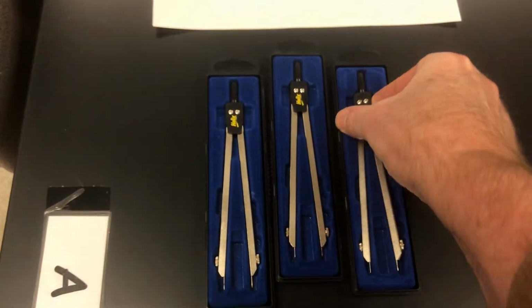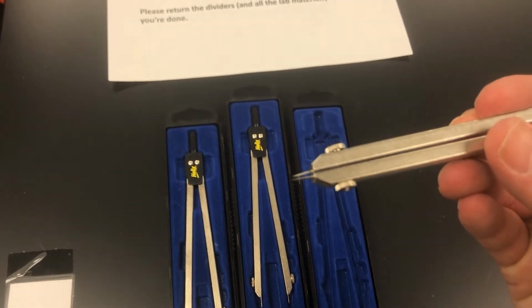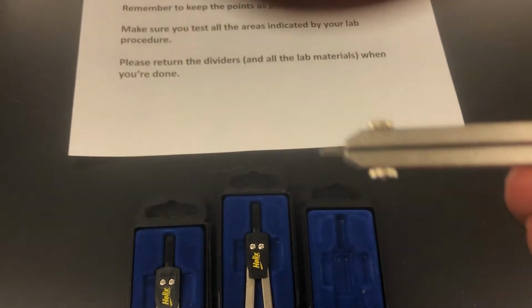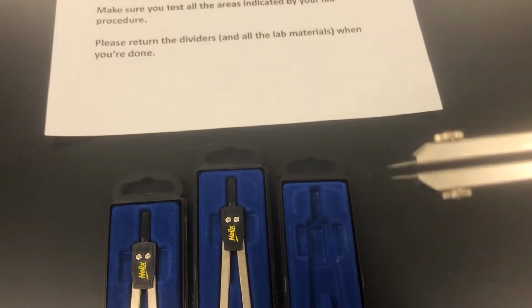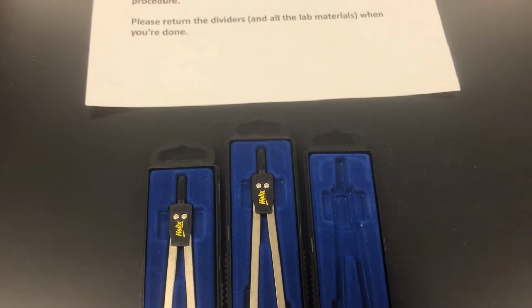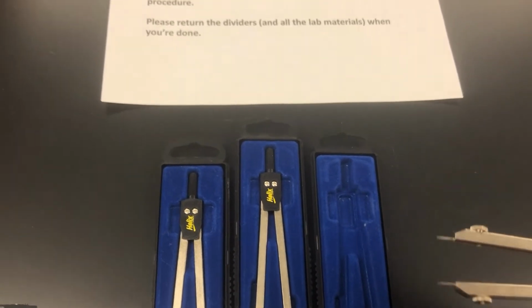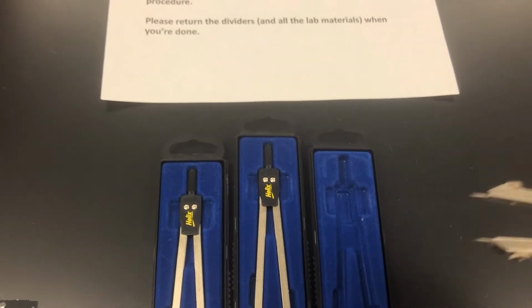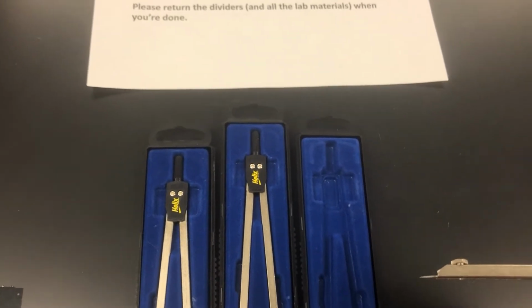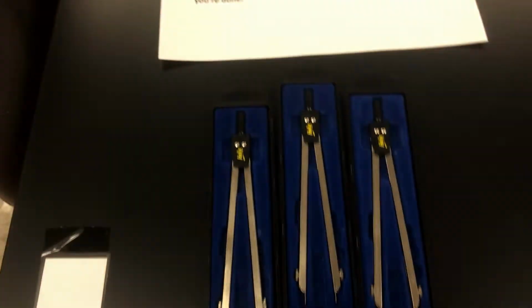For the somatic senses, we have the 2-point discriminators here. I've got 3 of them. They are just nautical dividers, and what you're going to do is start with them very close together, basically touching, okay? Then you're going to progressively move them further and further out until the patient can clearly discriminate 2 points when they know it's 2. Have them keep their eyes closed, and ask them, do you feel 1 or do you feel 2? They really should feel 2 separate stimuli when they have hit that receptor, that 2-point discrimination.